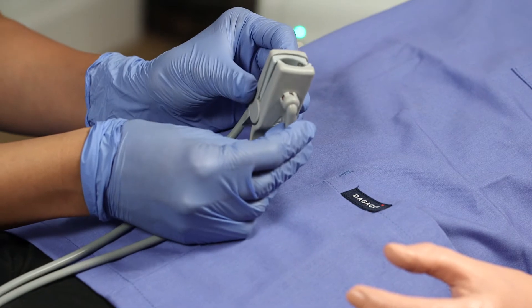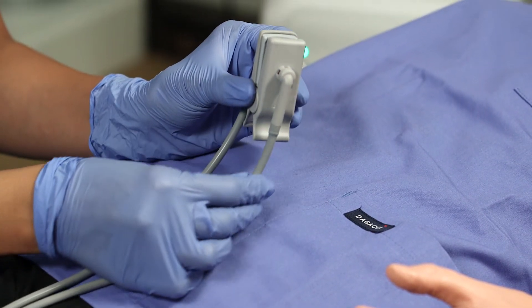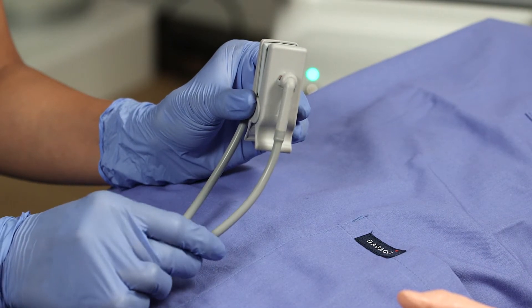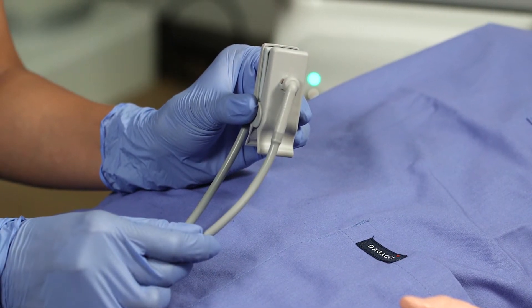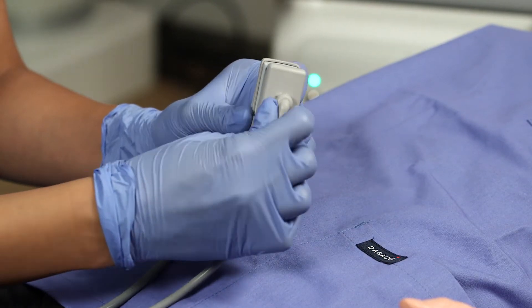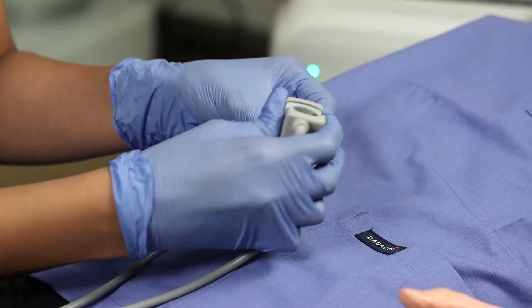When changing out the clips, be careful not to pull from the fiber optic part of the SpO2 probe. It is fragile and will break over time if continuously pulled. To change out the clips, pull from the hard plastic end and pull straight out. Then you will be able to snap in the clip you have chosen.